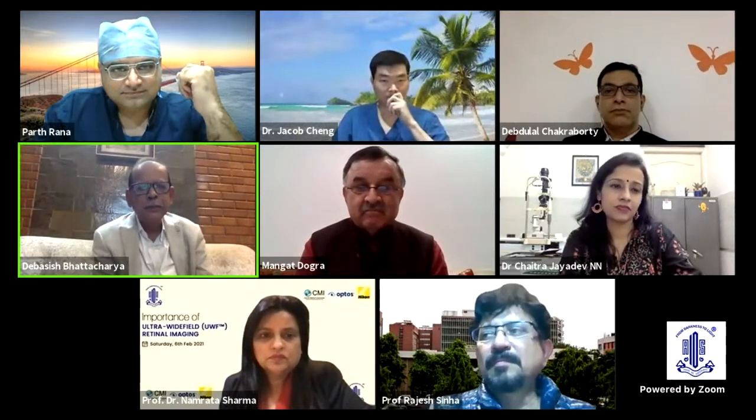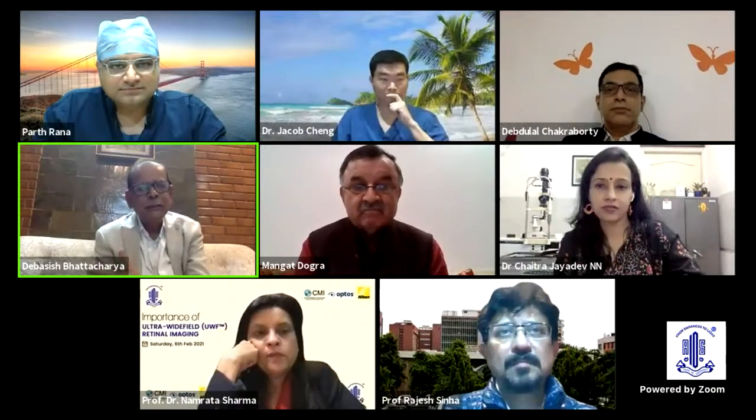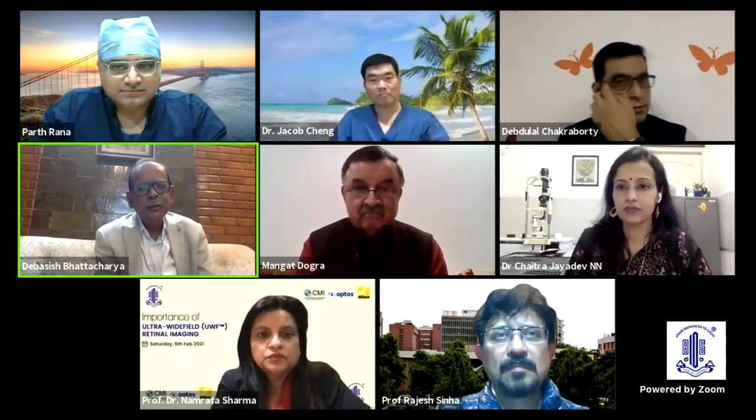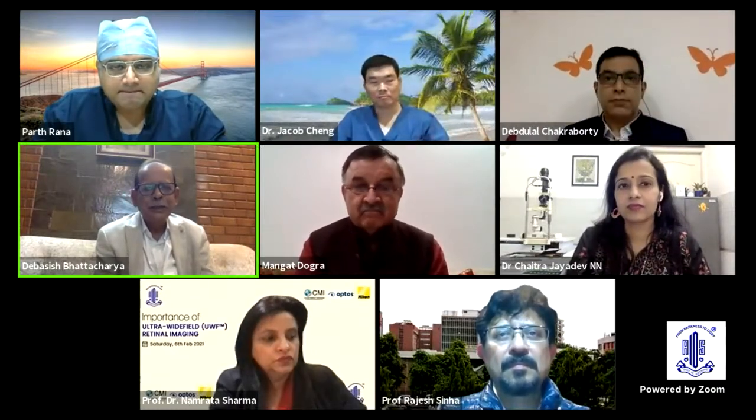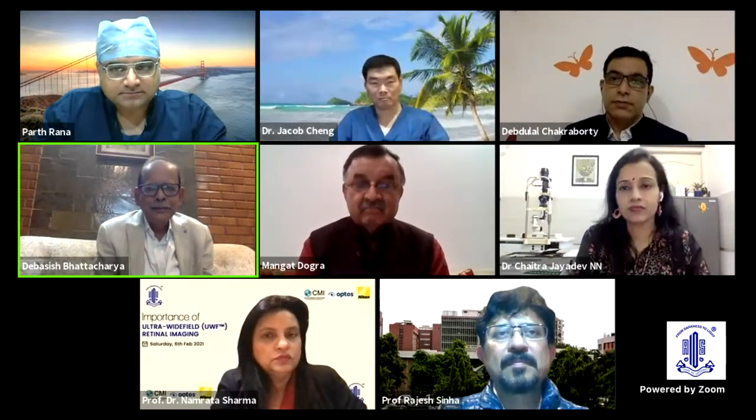Of course, for a myopic patient we could do indirect ophthalmoscopy, but in a busy clinic, wide field imaging would probably be an easier option. At the same time, it could be a documentary record which we can use in future for follow-up. So there are a lot of advantages which we can put in one basket and see going forward. So that's it.